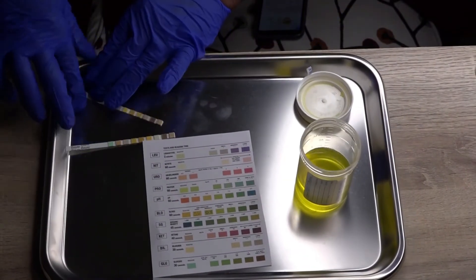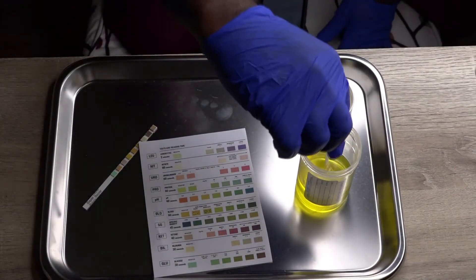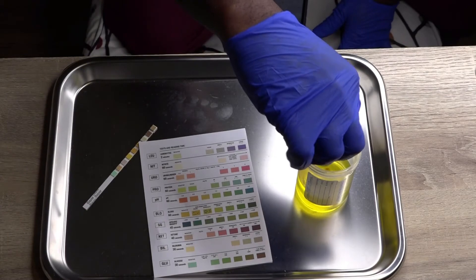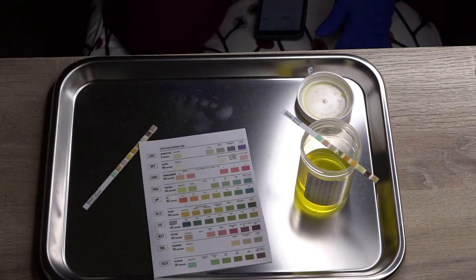So I performed hand hygiene, I donned my gloves. Now we are going to take this test strip and we are just going to simply dip it in the urine. Then we are going to lay it like this and we are going to wait for one minute and read results.